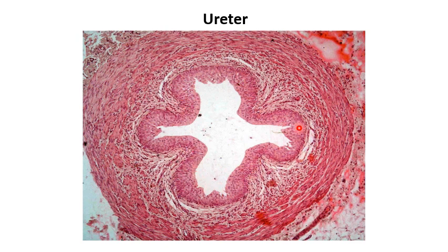Number 1, folded mucosa. Number 2, lined with transitional epithelium. How do you know it? Non-clear, non-wavy basement membrane, more stratified cells, and the nuclei are rounded. And the muscularis: there is no submucosa, and the muscularis is moderate in size.